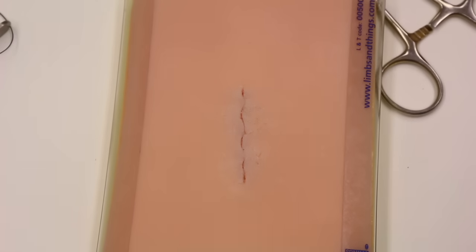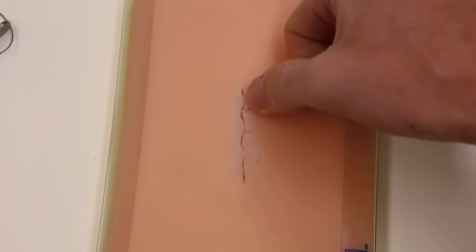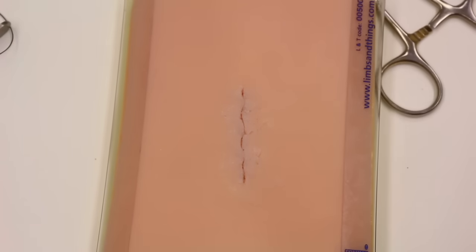All right. There you have your running subcuticular suture, your skin closed, no suture to remove, and typically a pretty cosmetic skin closure.